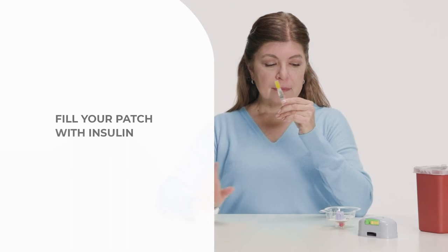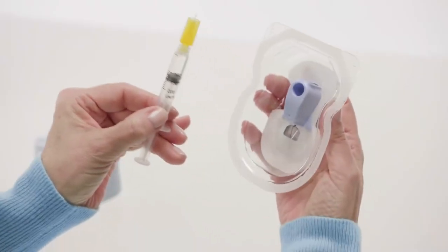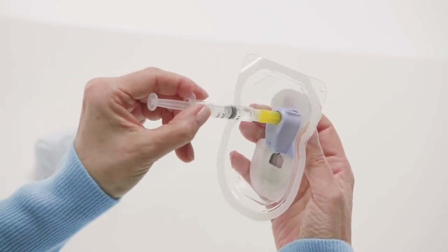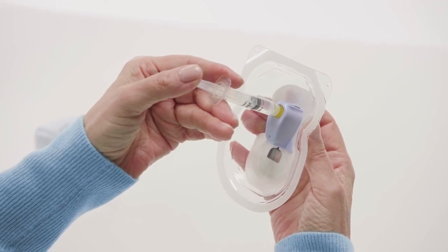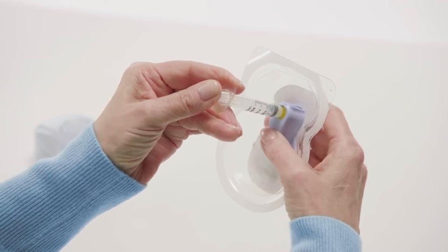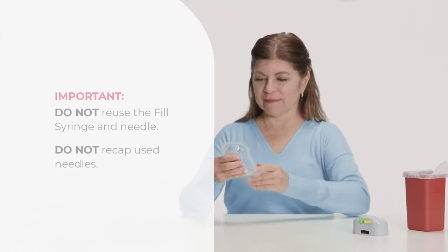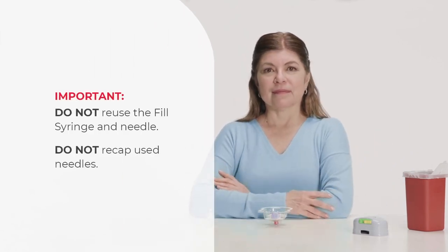To fill the patch, hold the tray firmly with the patch in an upright, vertical position. Insert the needle and syringe straight into the blue cap. Slowly push the plunger to fill the patch with all the insulin. Pull the syringe straight out and dispose of the needle and syringe in a sharps container according to local regulations. Do not reuse the fill syringe and needle. Do not recap used needles.